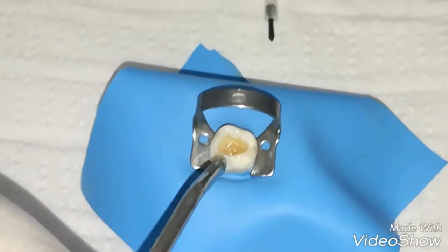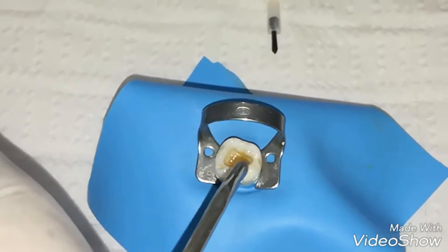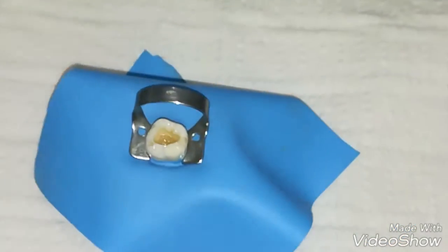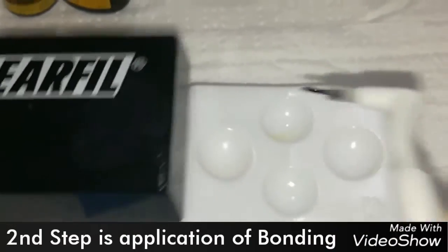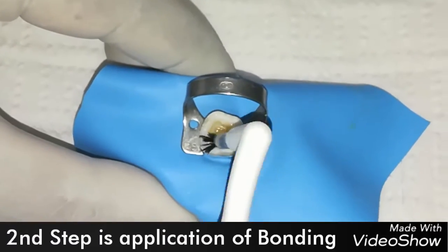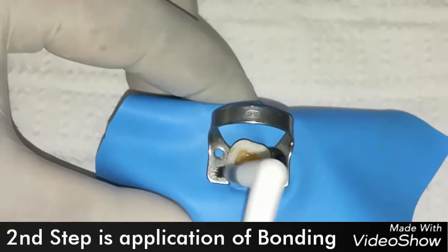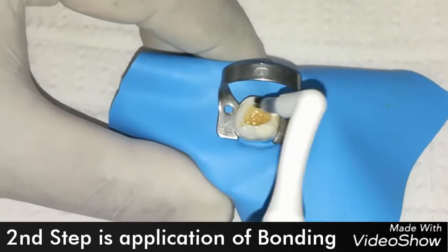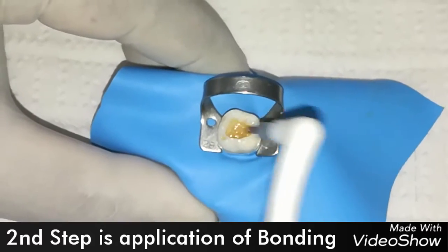Now we use some air to thin the primer with a gentle air blow. Now we are going to apply the bond to each and every part of both enamel and dentin.